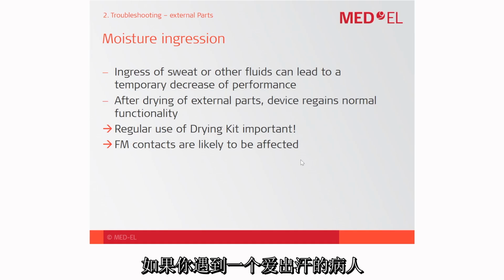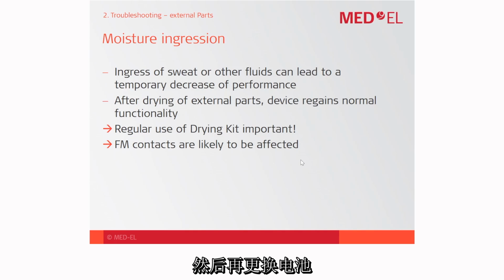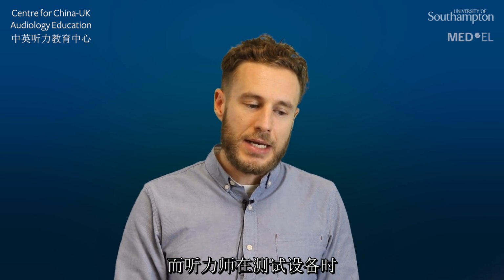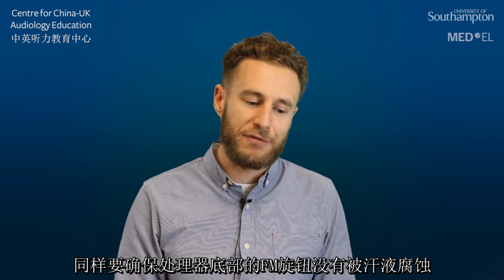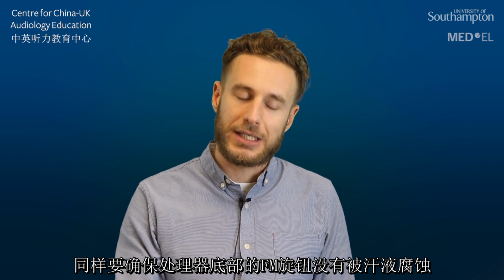So if you are confronted with a CI user who is having a sweat related issue, make sure that the processor battery compartment is only opened after the processor was dried with some cloth or fabric, and then that overnight the provided drying kit is used. So especially when you assess a processor, also make sure that the FM pins on the bottom of the battery frame are not affected by corrosion.